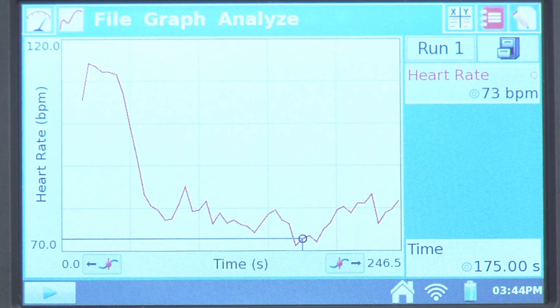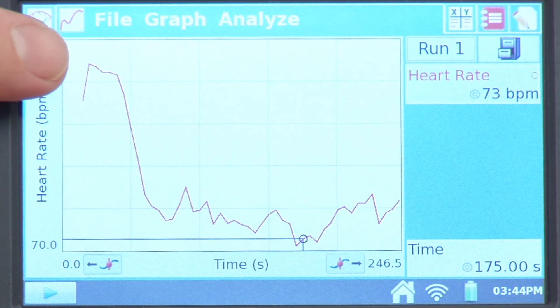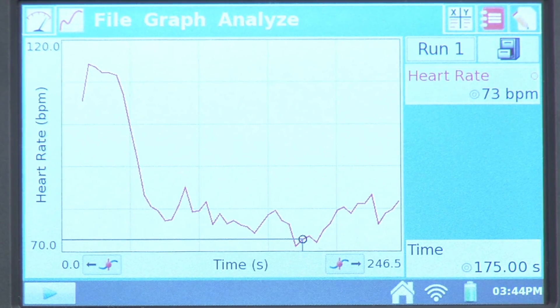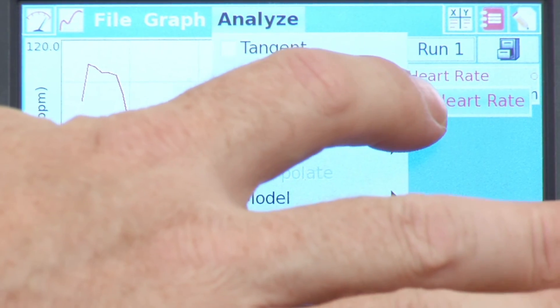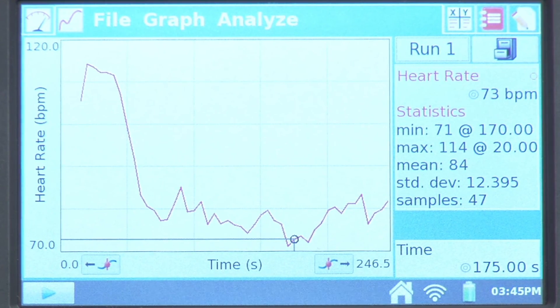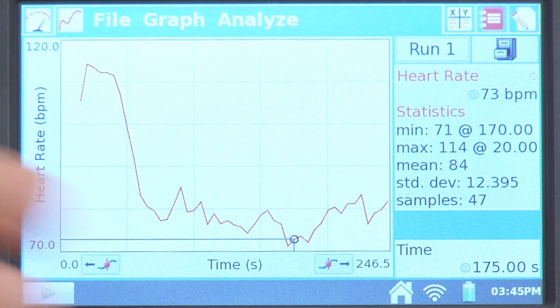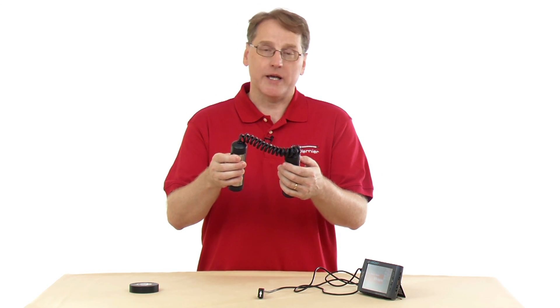Now that I have some data, we can look at the analysis. We can see that when I began collection and was talking, my heart rate was elevated, and then when I stopped talking and relaxed, it dropped to a lower value. To get numerical statistics, go to Analyze and then Statistics, and check the box. We can see in the meter that the minimum heart rate was 71 beats per minute at 170 seconds, and the maximum was 114 beats per minute at 20 seconds, along with an average. The hand grip heart rate monitor is used in biology and physiology manuals to measure human heart rate.